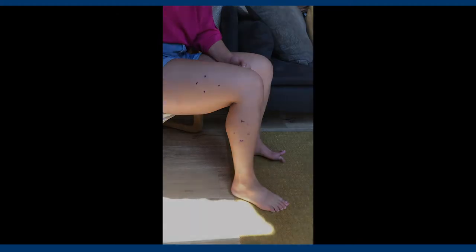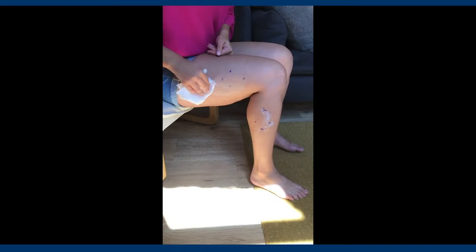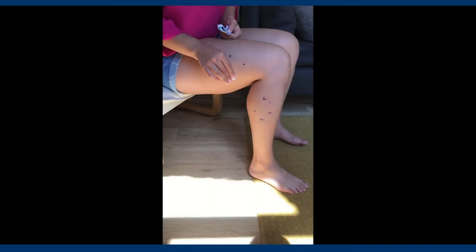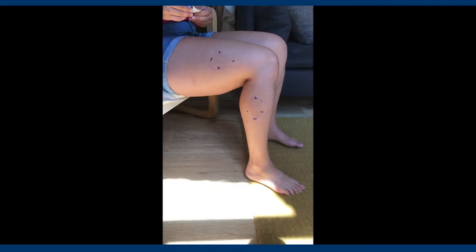Once both your white and blue ADPs are successfully removed, you will cleanse the area with soap and water. You will then use an alcohol wipe and let the area dry for two minutes before you place a new set of ADPs on the area.